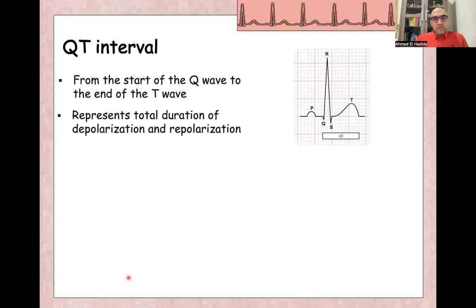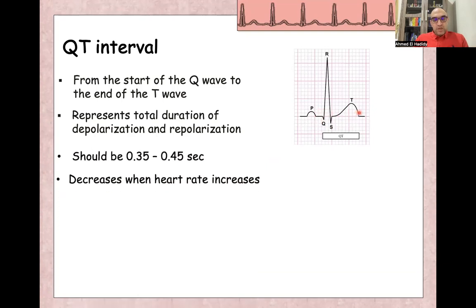QT interval from the beginning of the QRS complex till the end of the T wave. And this represents the total duration for ventricular depolarization and repolarization. Should be from 0.35 to 0.45 seconds and usually decrease if heart rate increases.